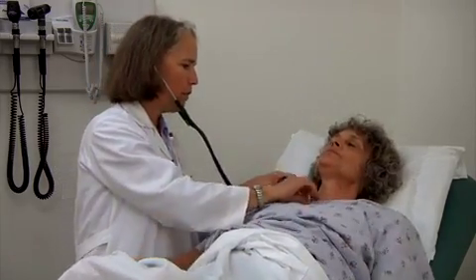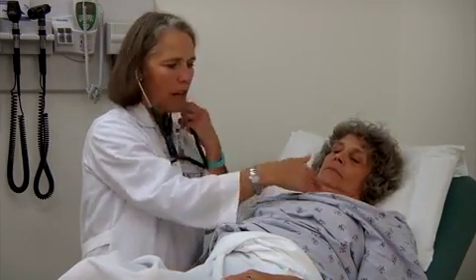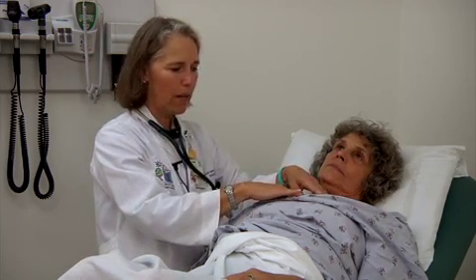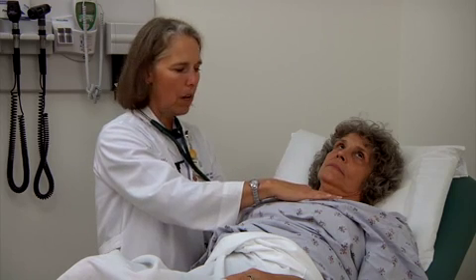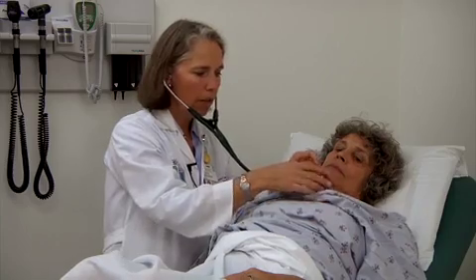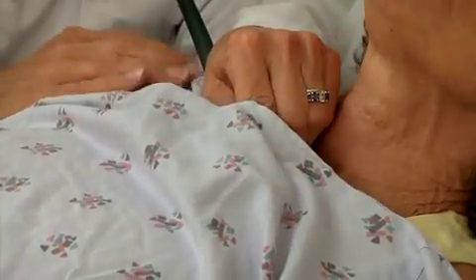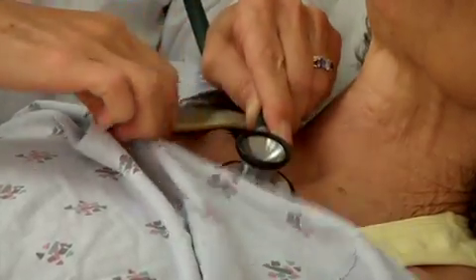And now, as we did before, we're going to expose just the little part here of the upper part of your chest. And with the sports bra, it's really quite easy. We can easily identify where the second intercostal space is. And we can listen just to the left and the right of the breastbone, to the pulmonary and the aortic area. That's really not much different. Again, if you want to, you can put the gown on top, exposing very little while you listen, and then move to the aortic area. So with a little modification, you can do this well.